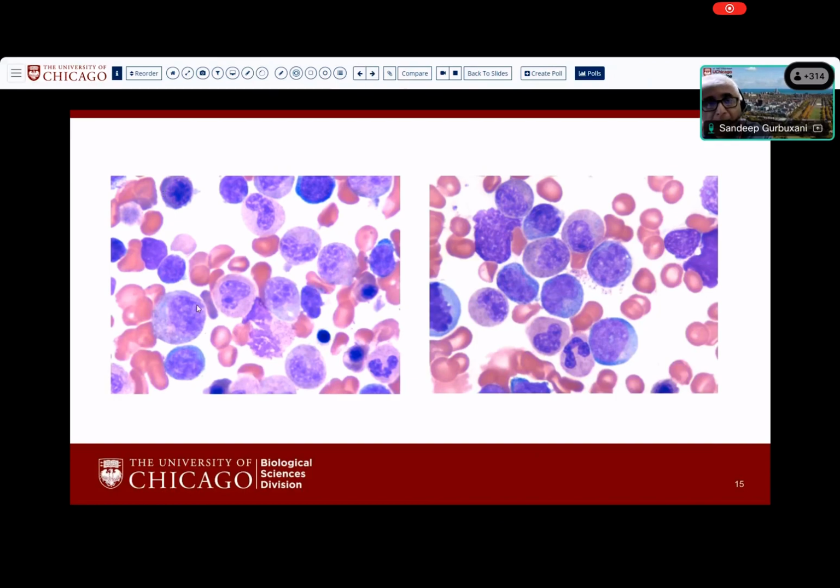see are fields like this. And so again, you have just a snapshot from the slide that we were looking at before, the whole slide that we were looking at before, where you can really track the entire ontogeny of this cell, starting from this myelocyte here to a metamyelocyte here, another metamyelocyte here, then turning into a band, and then a segmented neutrophil here. So this is one field of that slide.